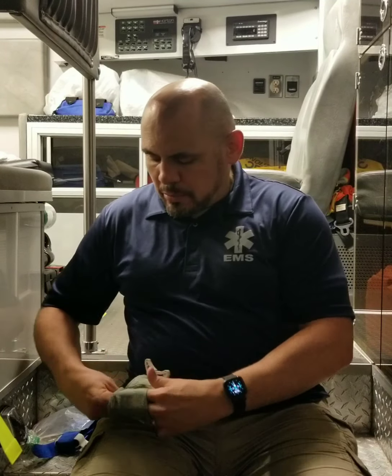It's a tourniquet. Now there's two rules for the tourniquet. You can do what it's called high and tight. In other words, let me go back. This is for extremities. This is not something you will put around your neck or your body. It's just not going to fit. You would put it on your legs or your arms. So this could go all the way up here if there's a cut anywhere below it. Another rule of thumb is 2 to 3 inches above the cut.